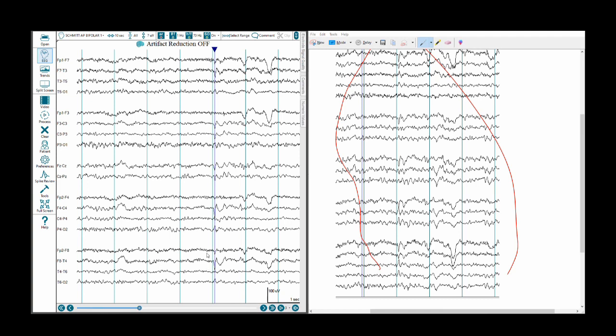As we move to the right hemispheric electrodes, we see a downward deflection due to C4 being really close to where the discharge is maximally represented over the scalp. C4 is more negative than P4, so there is going to be a downward deflection. And P4 is involved in this discharge, so P4 is more negative than O2. In this case, it is the fact that there is a phase reversal with C4P4, for this particular example, sharing the same magnitude, recording the same voltage. So they are equally complicit.